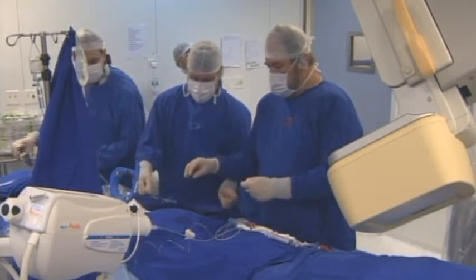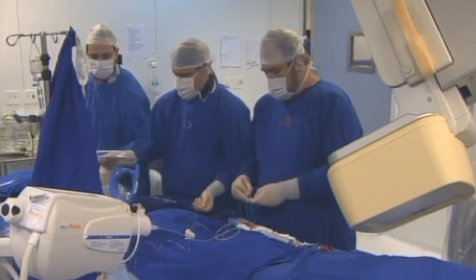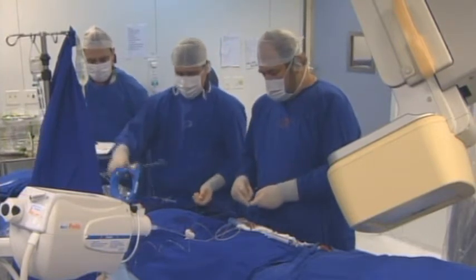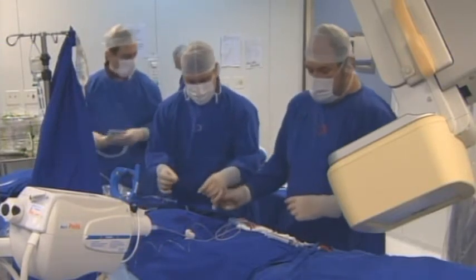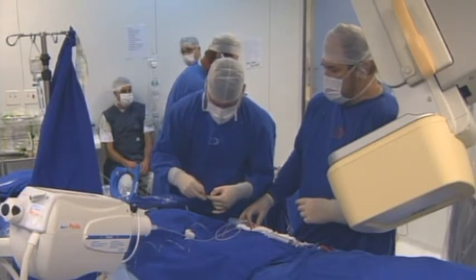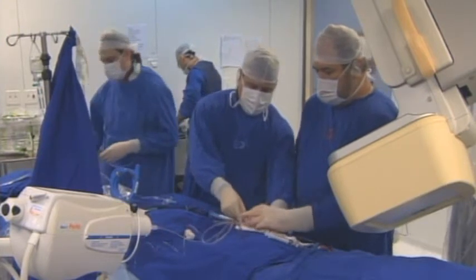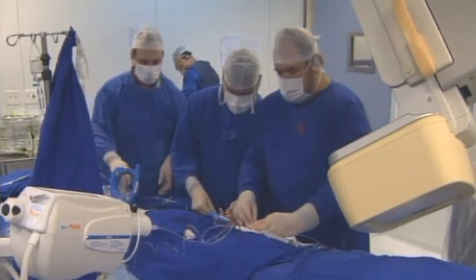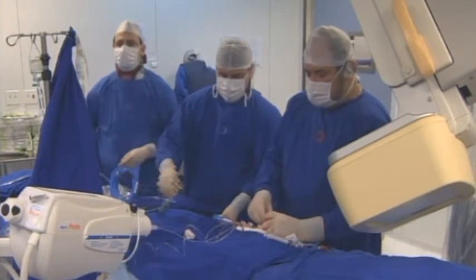So Alex, to your question, if you really don't have the resources, one of the things you can take is the COURAGE approach. You treat the lesion that you think is the culprit with a stent, and the rest you just manage with optimal medical therapy. That's probably going to work in terms of mortality and MI. If you need to convert, you convert. So you leave the right untreated, I mean, medically treated.